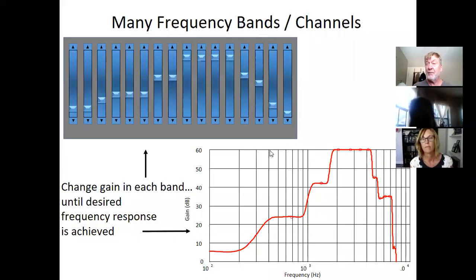I'll give you a little heads up, though. With digital noise reduction, when you reduce the gain for the low frequency or for noise, guess what? You throw out the gain for speech as well. If digital noise reduction is being used in these 4 channels, let's say, for example, then if I reduce the gain for the noise in those channels, I'm reducing the gain for speech in those channels too. Digital noise reduction tends to throw the baby out with the bathwater, but it's still comfortable. It's a comfort thing, and it makes the client feel a whole lot more comfortable than sitting there turning down the volume. The hearing aid automatically adjusts. So these are good things about it.